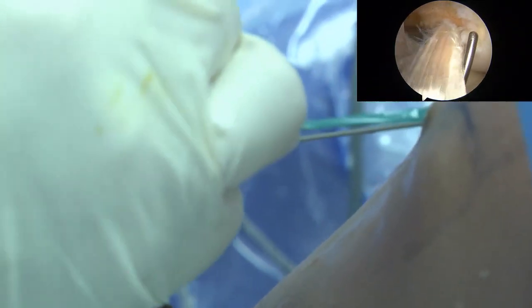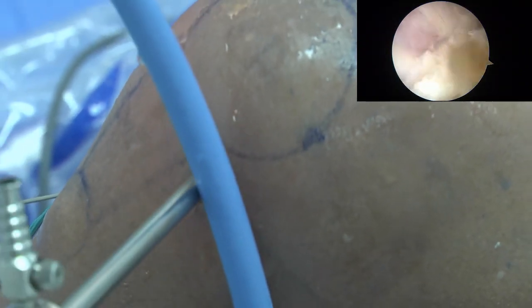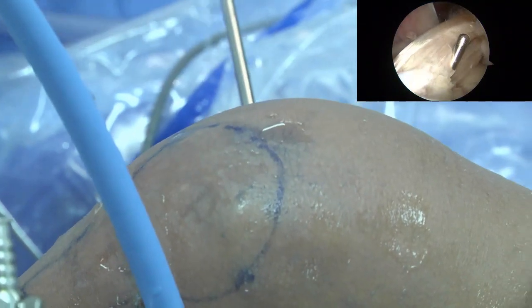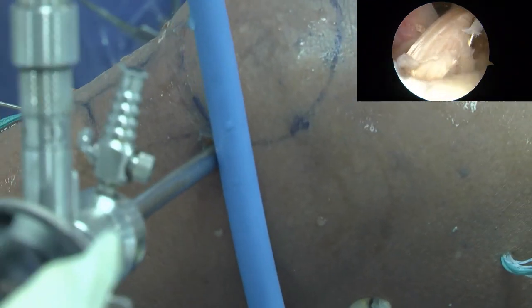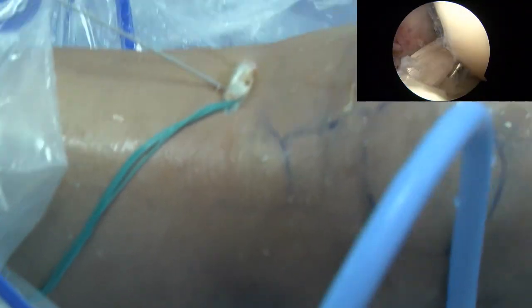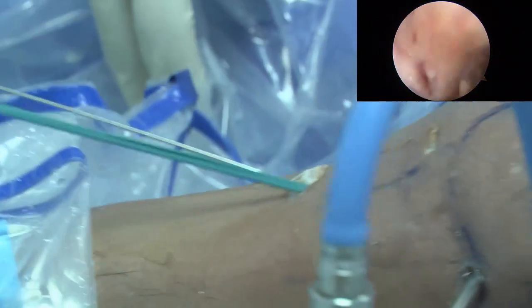那我现在看到导针是在移植物的后外份，这个是非常理想的，起到几方面的作用。首先呢，胫骨隧道的前内份和后外份的长度它是有一点点偏差的，那我们是把移植物偏到前内份的话呢，前内份的隧道是偏长，所以接触面就多了。那另外呢，这种调整可以使得移植物的方向更加斜平，也就符合它自然走向。I will show that. 那如果没有这样子的操作，那移植物可能就会偏到外侧，就会引起外侧壁的撞击。Okay.